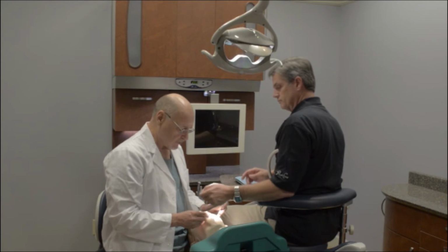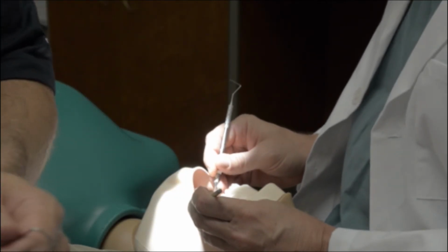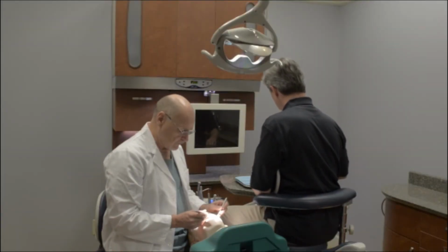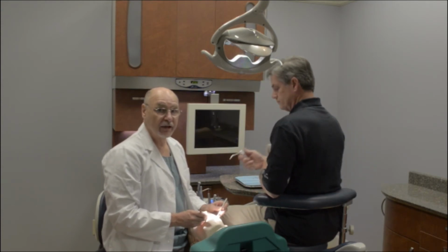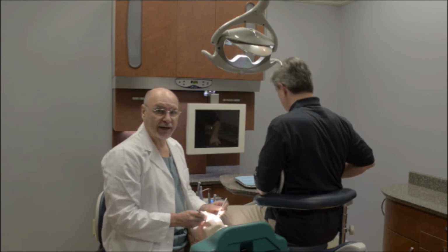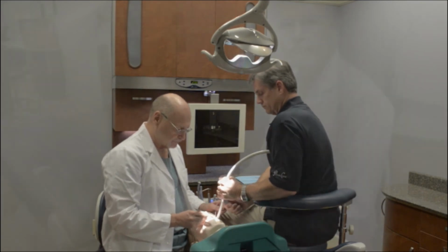Let's see another instrument transfer. The small finger of the left hand takes the instrument that I no longer want. I let go. They deliver the new instrument to me, and I take that without losing my visual field or losing my finger rest. I go right back to the mouth. I'm treating the patient, and the procedure goes approximately 20% faster with these instrument passes. Then, if necessary, the assistant can bring up the high-speed suction and the three-way syringe again to assist in whatever process needs to be accomplished.